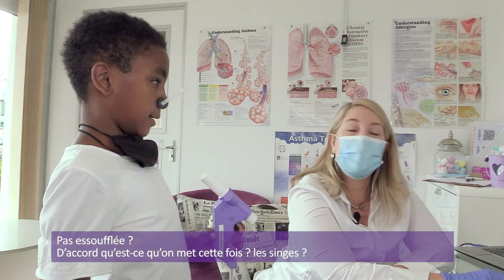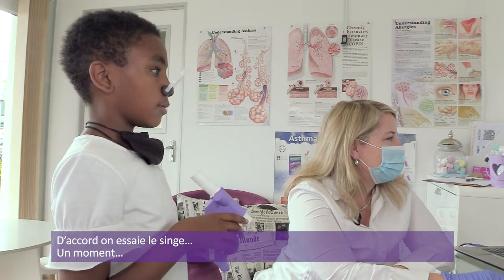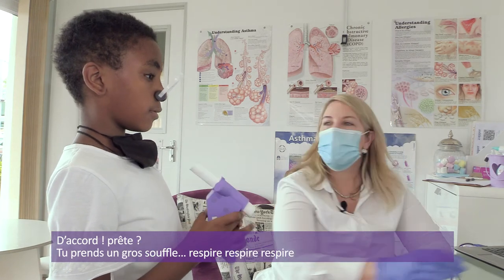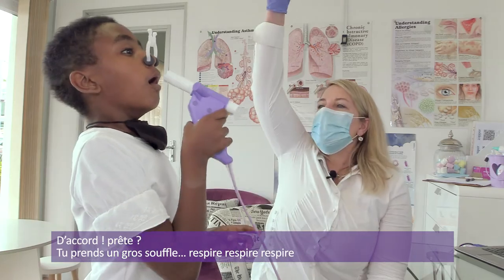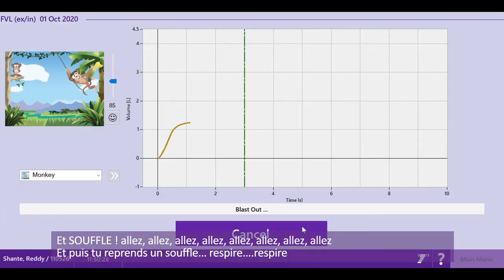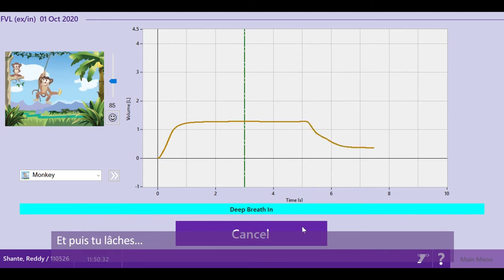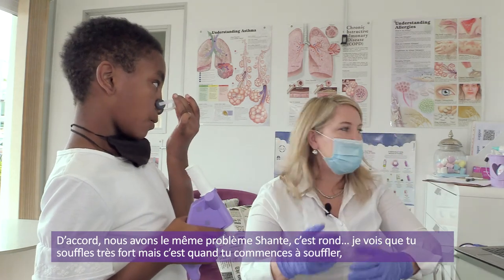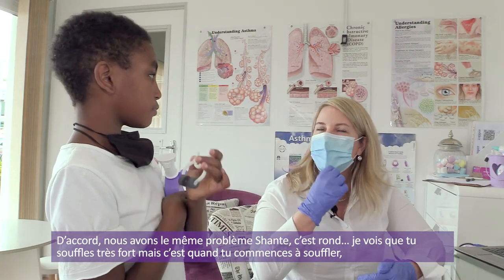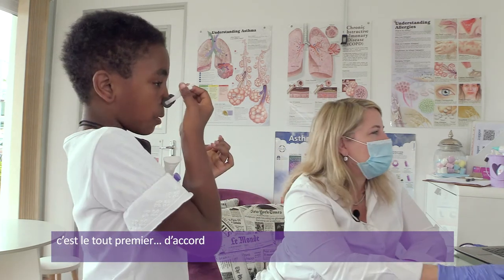All right, what do you want to try this time? The balloon. Monkey. Okay, let's try the monkey. Hold on a sec. All right, are you ready? Yes. Okay, take a nice deep breath in. Fast as you can. And breathe in fast to the top. Relax. Okay, we've got the same problem, Shanti. It's round. So it's like I can see how hard you're blowing, but it's that initial burst.